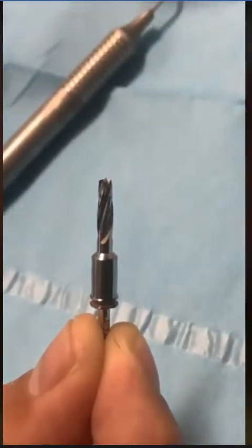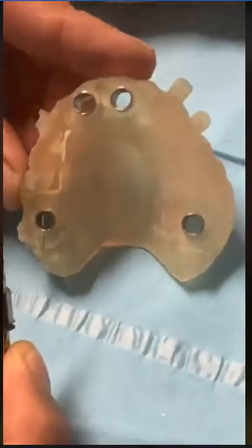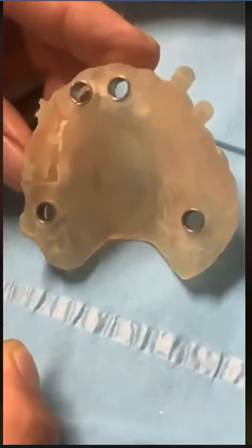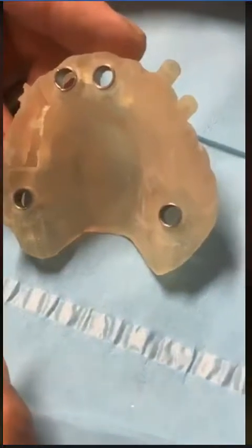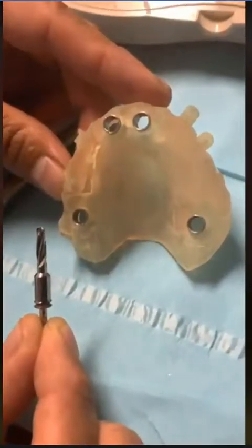I'm going to show you a guide that we did yesterday. Okay, so here is a guide, right? This patient got 4 implants, and we're going to discuss this particular case together. This patient got 4 implants yesterday, okay?